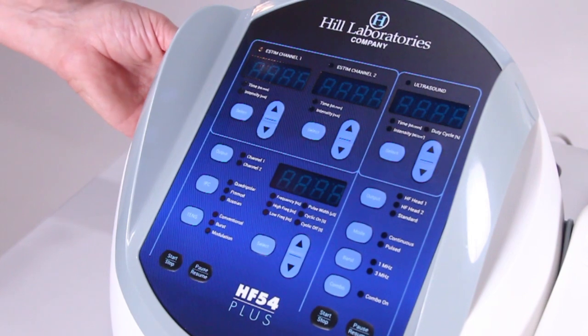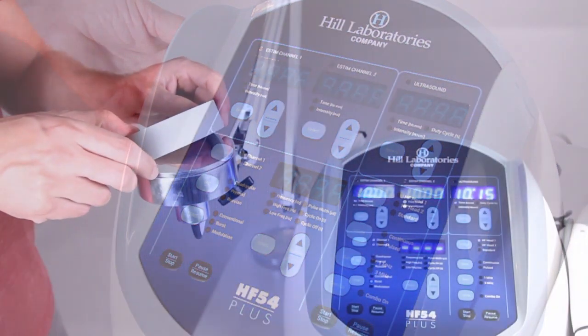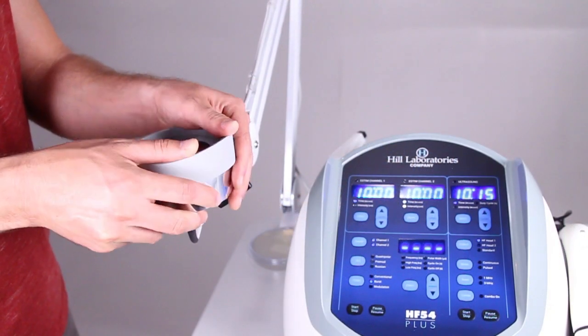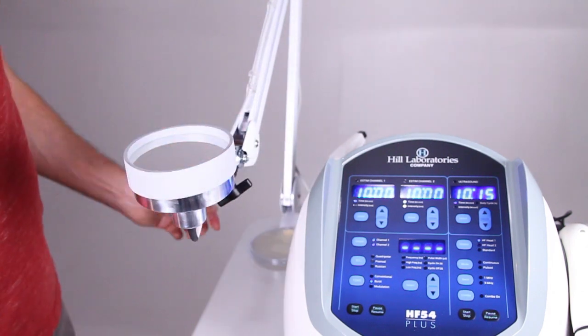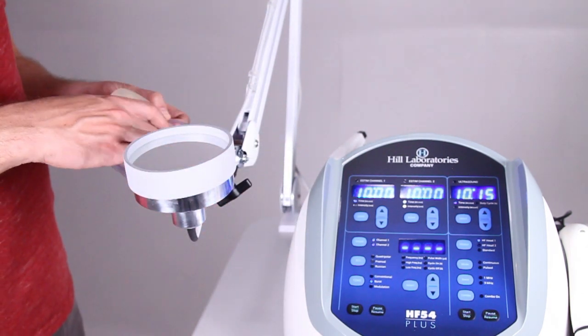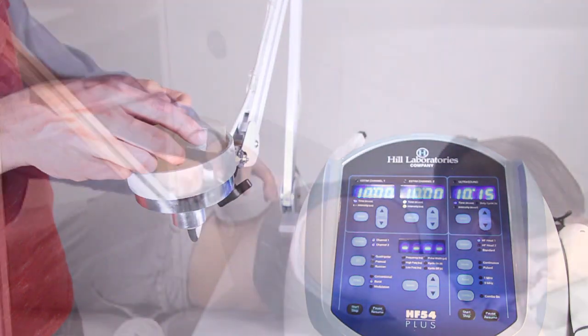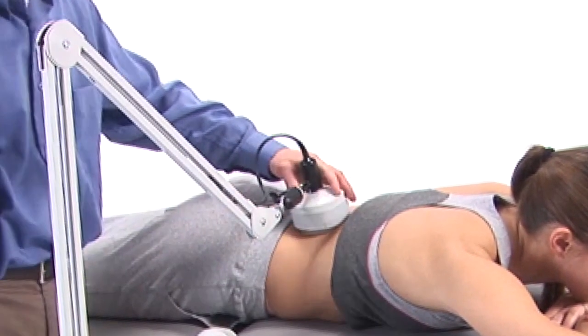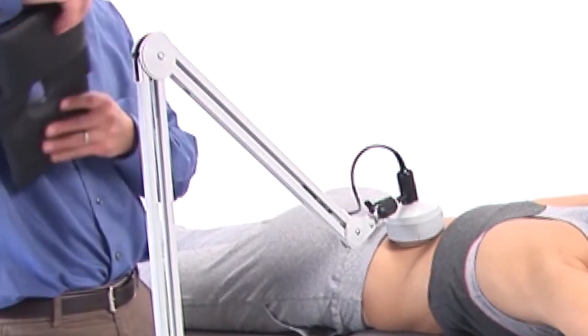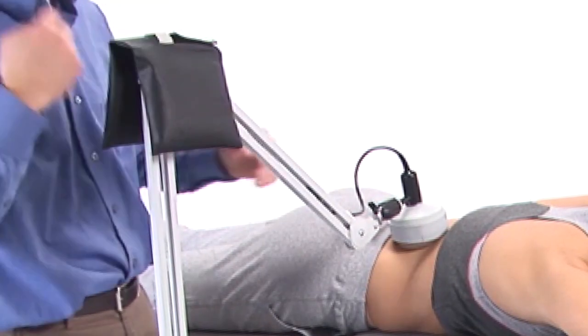Setup for the HF 54 is designed for speed and accuracy. Turn on the unit using the power switch. Place the retainer ring around the sound head as shown, and then place the gel pad into the retainer ring. Position the sound head on the desired area of your patient.